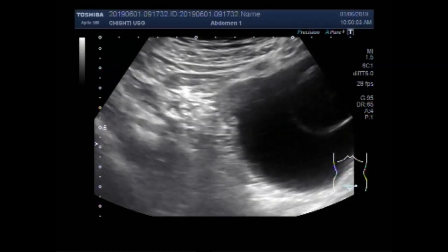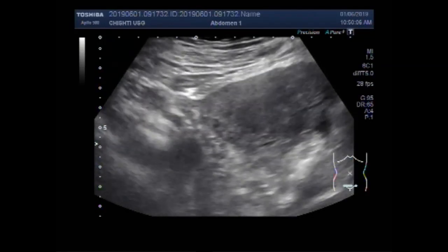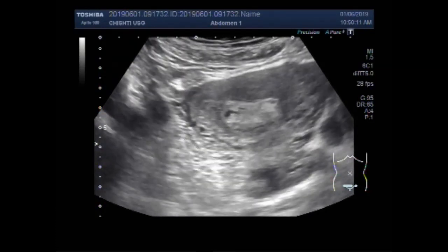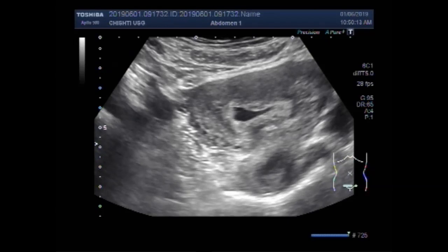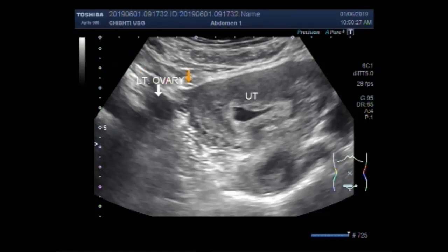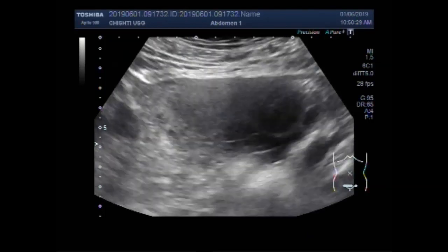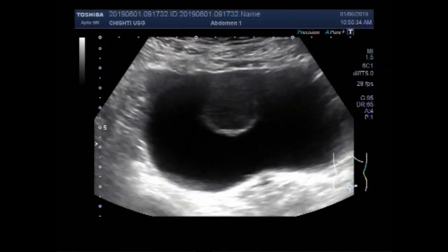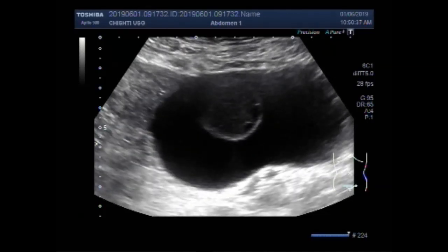You can see a large ovarian cyst. This is the uterus and this one is the left ovary. Now the right ovary — you can see a large, a huge ovarian cyst.